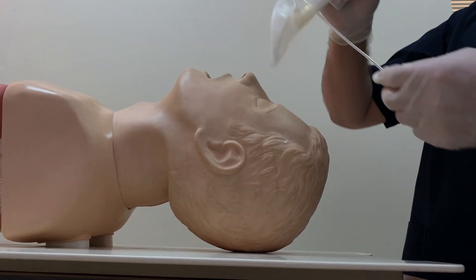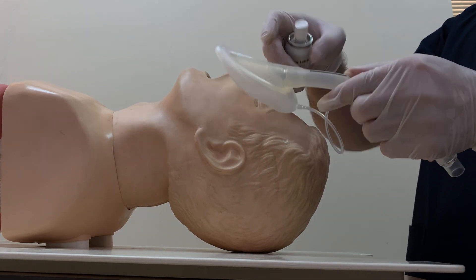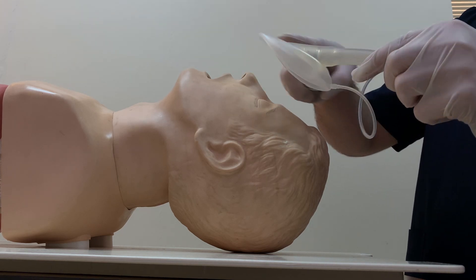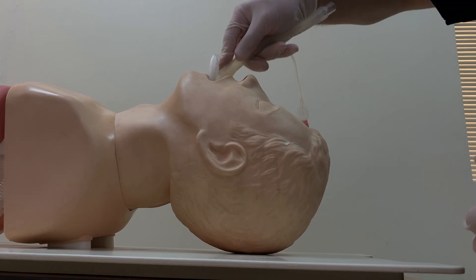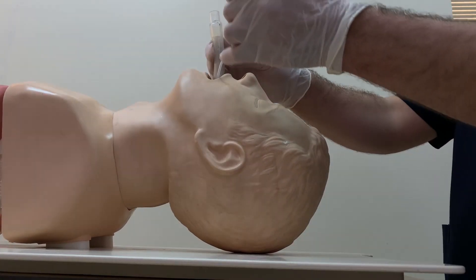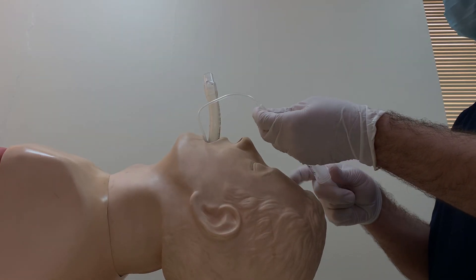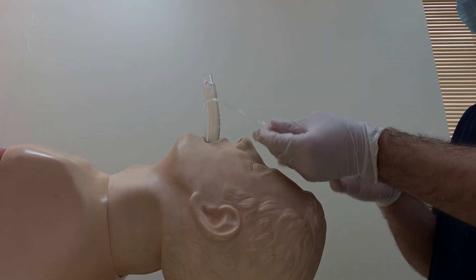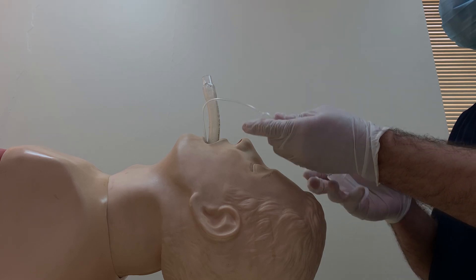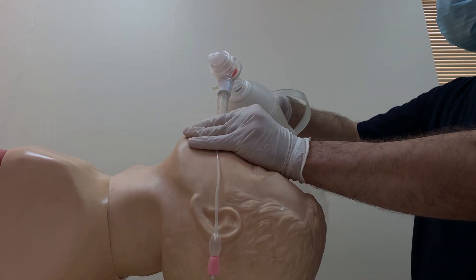We will lubricate the LMA with xylocaine gel. For the purpose of this mannequin, we will lubricate it with this material. It will be inserted until there is resistance, then we inflate the balloon. It is written on the device how much air to push. It may come up slightly — that is okay. It can then be connected to the bag.